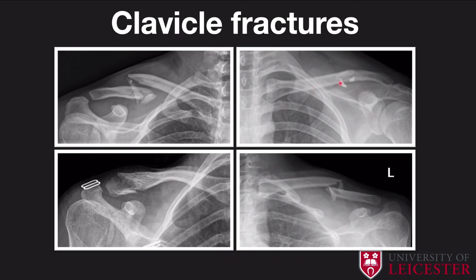A few other examples of clavicular fractures demonstrate the importance of two views — in one view it may look acceptable, but the second view reveals how much displacement there is. Look for tiny fracture fragments; if they unite in an odd position, they can cause continuous pain or form a palpable hard lump from callus formation. These small fracture fragments should be commented on and operated on if possible.